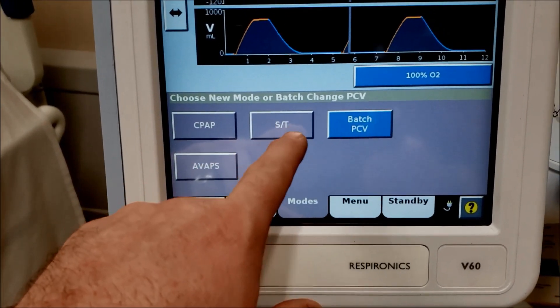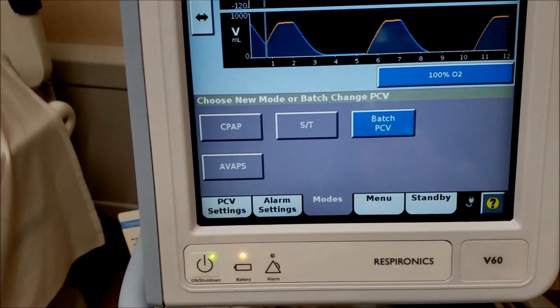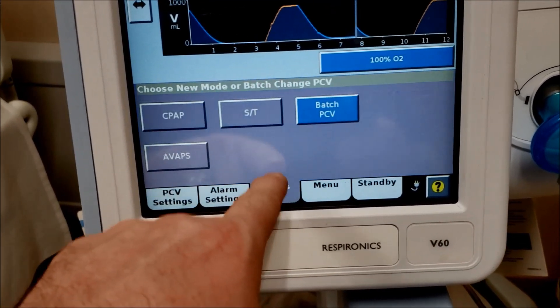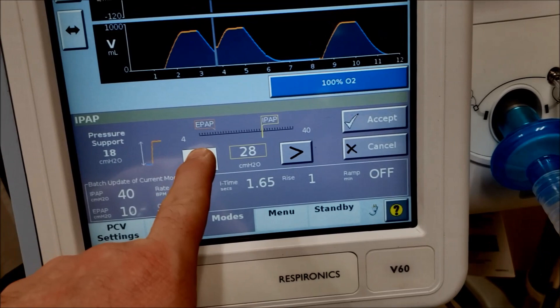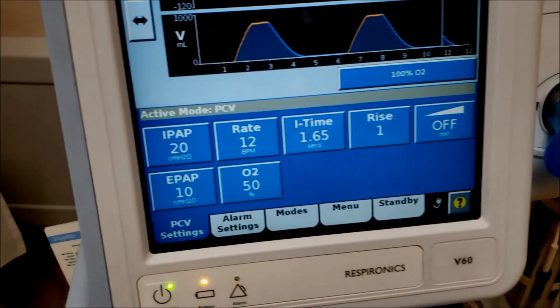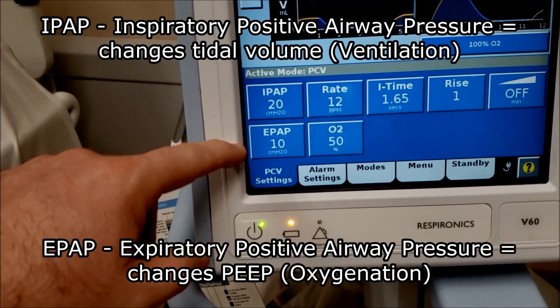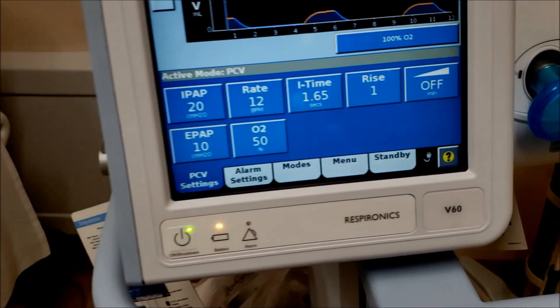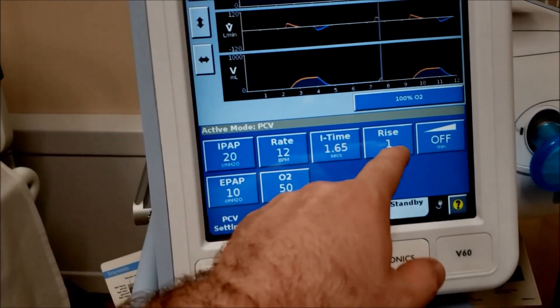For ventilation via ET tube or trach, go to modes. This machine has three options: CPAP, ST (spontaneous timed), and AVAPS — there's a separate video on AVAPS. We're using PCV — pressure control ventilation. I already have it on PCV. Looking at settings: we have IPAP, EPAP, rate — an actual set rate — and FiO2 of 50%. We have an I-time, which in PCV is fixed rather than variable, and that's great for oxygenation problems.